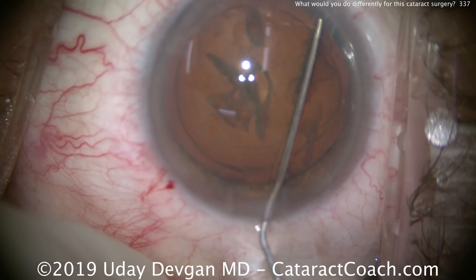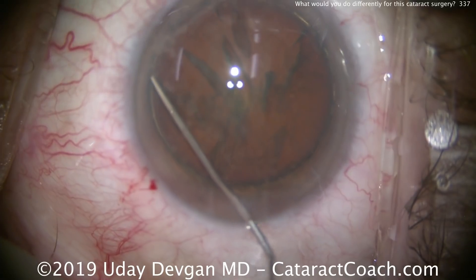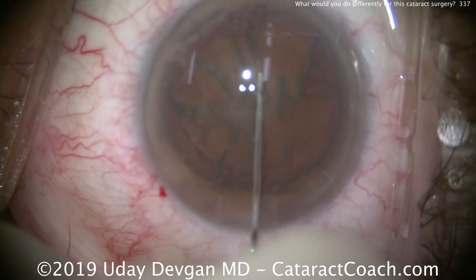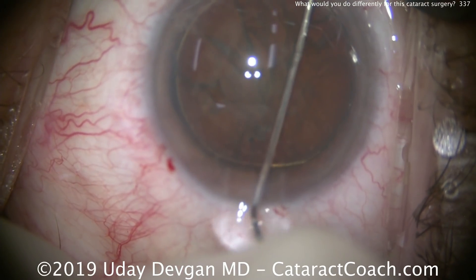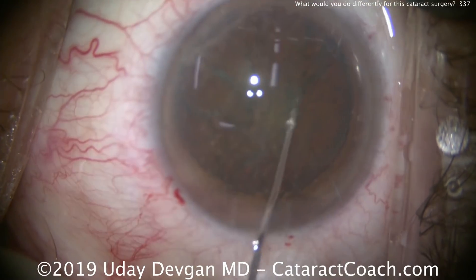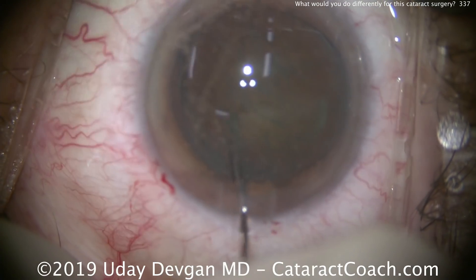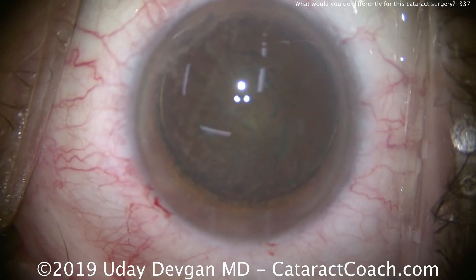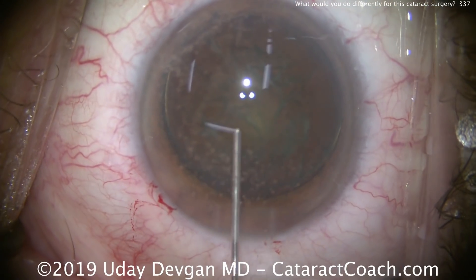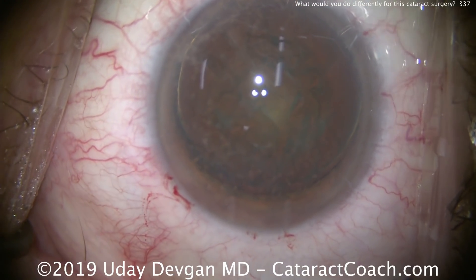We'll do some hydrodissection — just gentle, get a few waves, there's a delineation. We still have good protection of the endothelium with the dispersive viscoelastic. We'll see if the nucleus will rotate; maybe a little more hydrodissection. Now, the next important move is: you always lose a little viscoelastic when you do the hydrodissection. So now put in more dispersive right here in the center — put in more. That just gives a little bit of added protection.